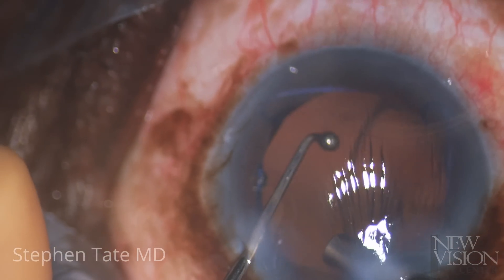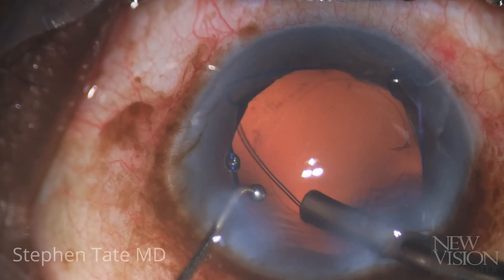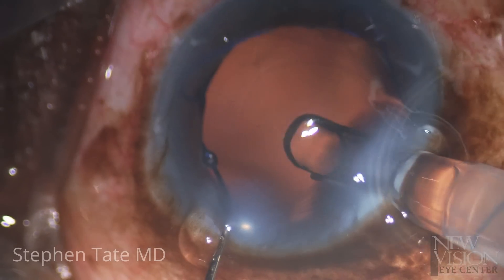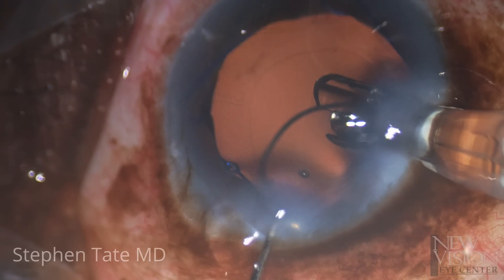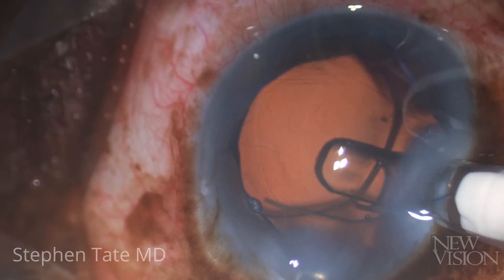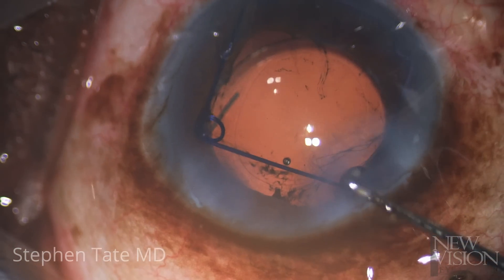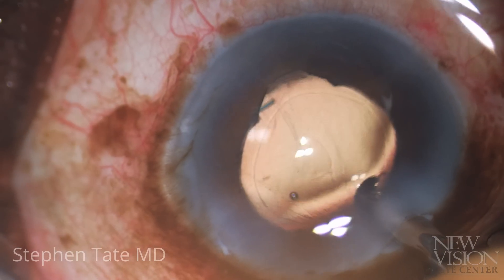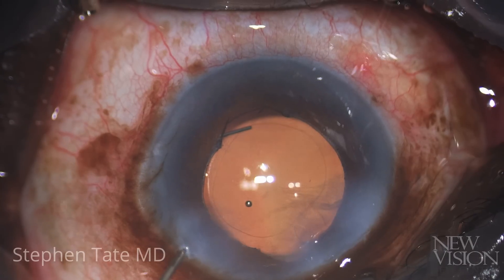A capsular tension ring is placed followed by a three-piece IOL. The Malyugan ring is then removed and viscoelastic aspirated from the eye. Finally, the case is completed with intracameral antibiotic.